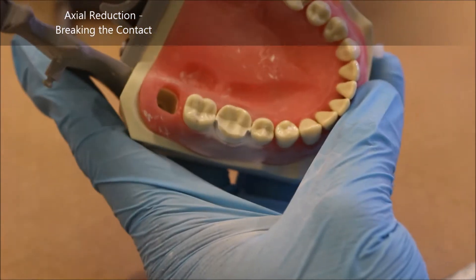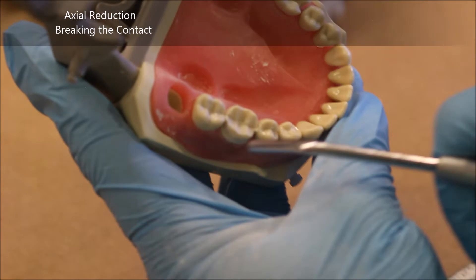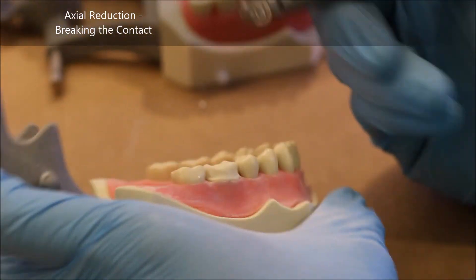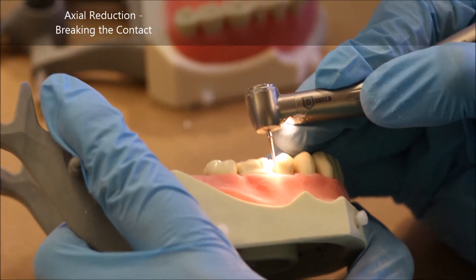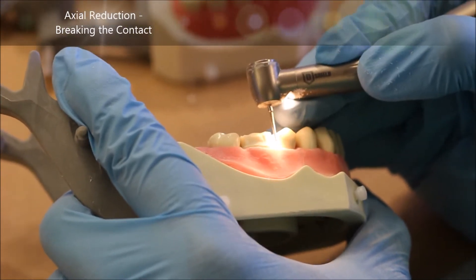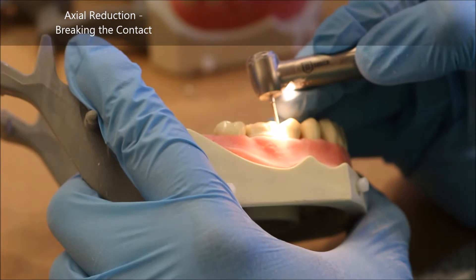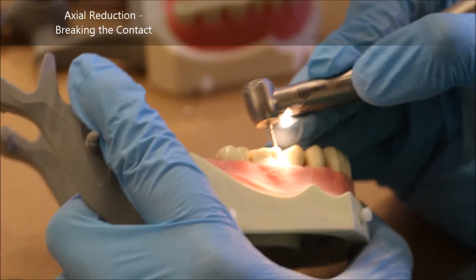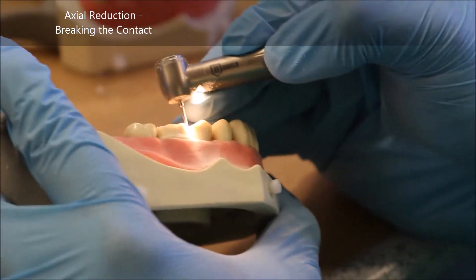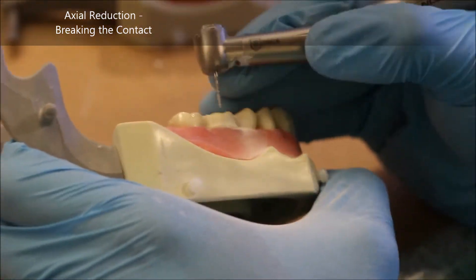As you can see, I've reached the interproximal contact and now I have to be extremely careful so as to not nick any adjacent teeth. It also helps if you have a very steady hand, but if you do not, you can increase the speed of your burr's rotation — i.e., step down on the rheostat — in order to have it cut in a smoother fashion.